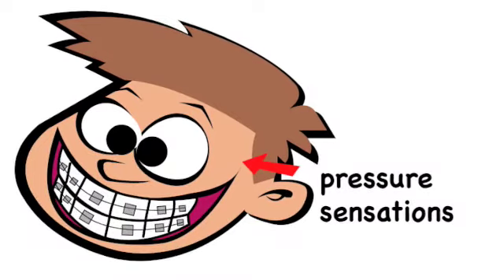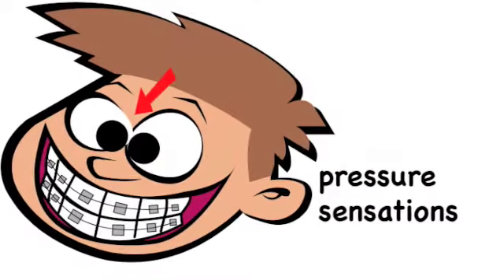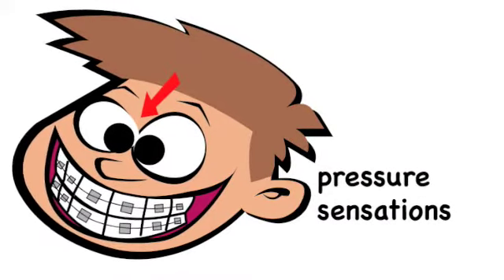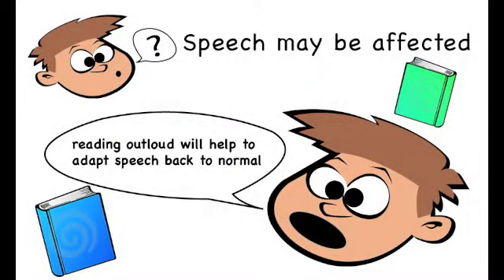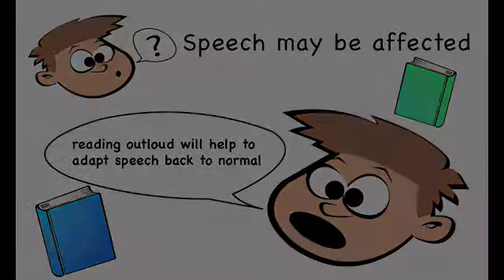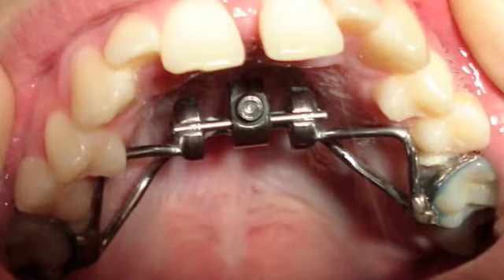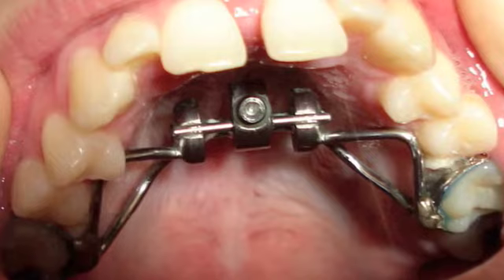During the expansion process, you can expect pressure sensations at the cheekbones and possibly between your eyes. This sensation is temporary and will go away within minutes. Your speech may be affected at first due to the expander. However, reading out loud will help to adapt back to normal speech. You may notice that your front teeth will slowly move apart. This is a sign that the expansion process is working properly.